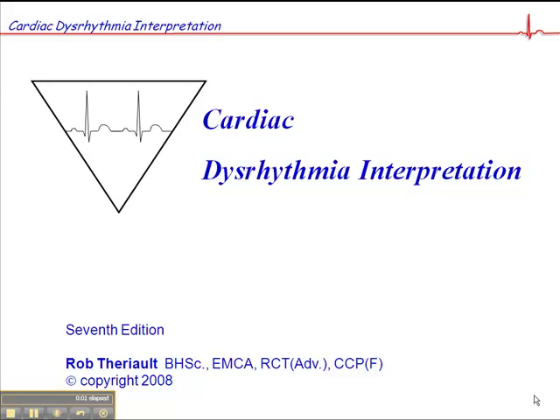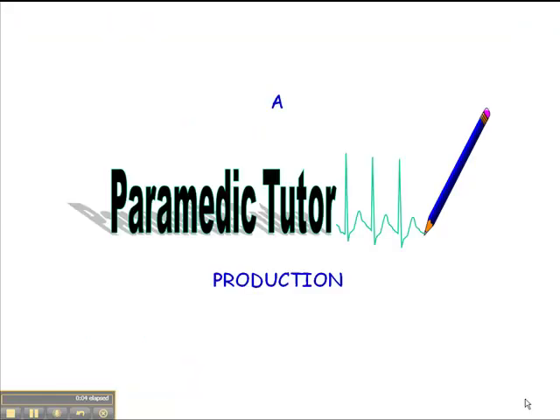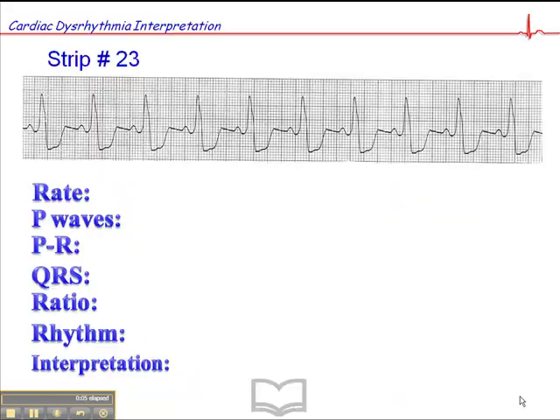This is exercise number 23 on page 96 of your cardiac dysrhythmia interpretation workbook. Let's start with the heart rate here, which is approximately 84.